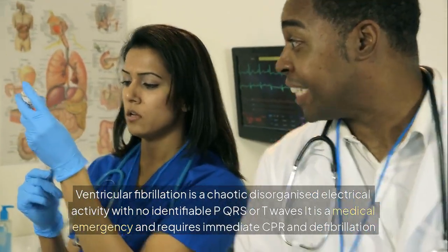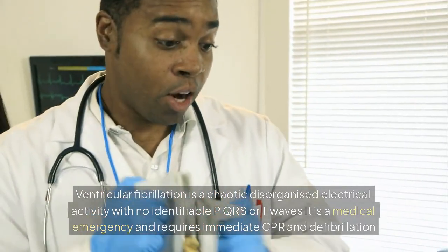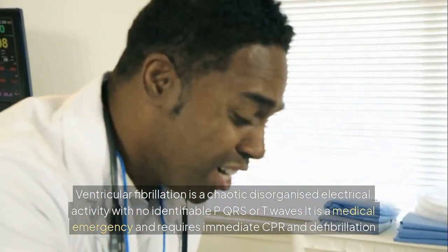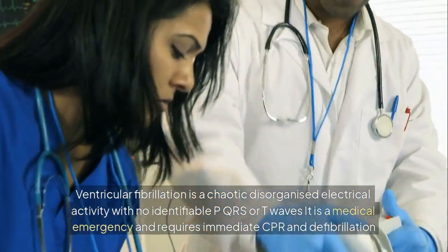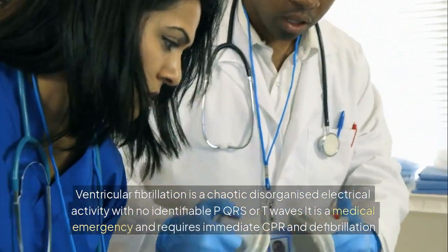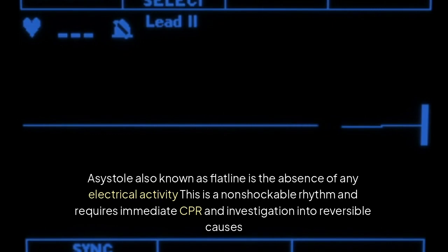Ventricular fibrillation is a chaotic, disorganized electrical activity with no identifiable P, QRS, or T waves. It is a medical emergency and requires immediate CPR and defibrillation. Asystole, also known as flatline, is the absence of any electrical activity. This is a non-shockable rhythm and requires immediate CPR and investigation into reversible causes.